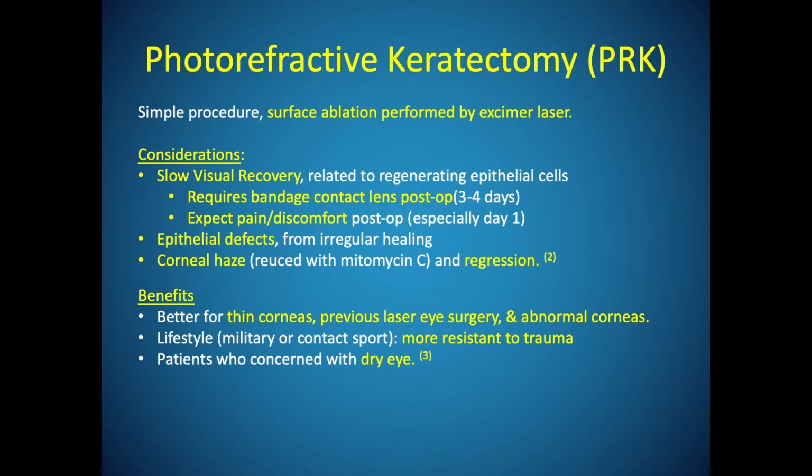Patients will expect a slower visual recovery with more discomfort. There is increased risk of corneal haze, epithelial defects, and regression, especially at higher refractive errors. However, this technique remains a favoured option in a number of situations, taking into account the quality of the patient's cornea, lifestyle factors, and concerns such as dry eye.